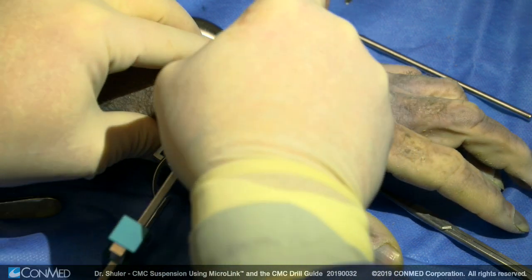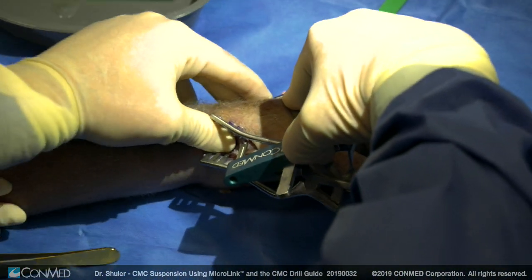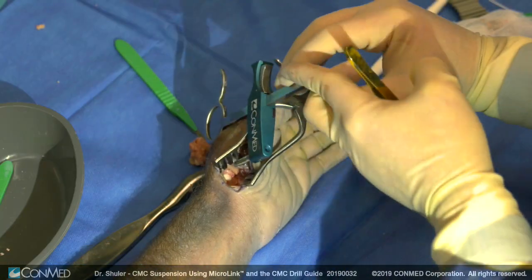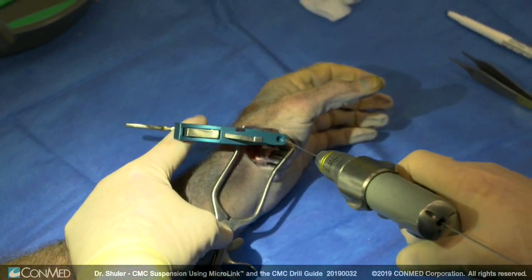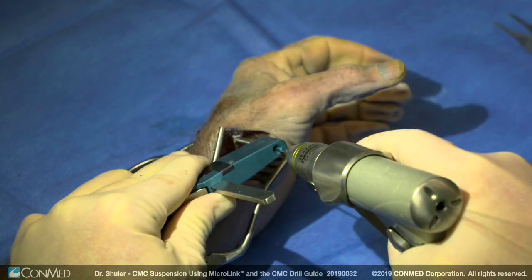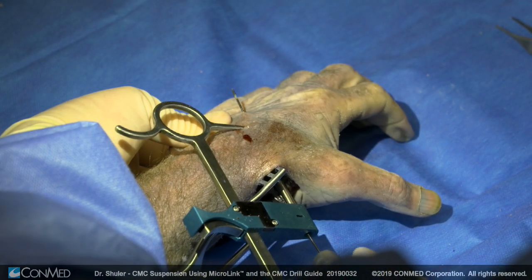Next, a small incision is made at the flare at the base of the index metacarpal. The CMC drill guide is inserted with the paddle placed just volarly and proximal to the thumb metacarpal. The drill bit is then inserted and drilled from the thumb metacarpal out through the dorsal aspect of the hand and through the index metacarpal.